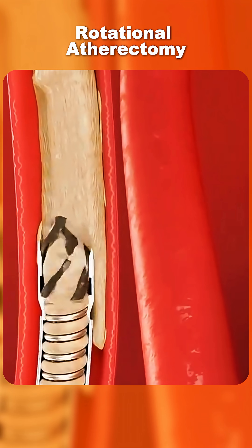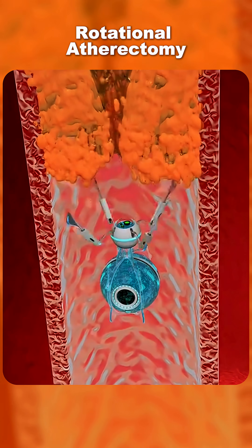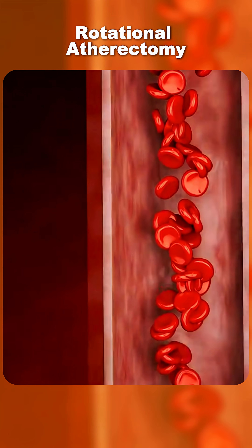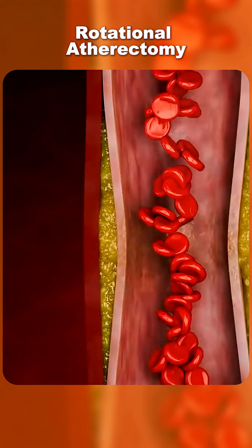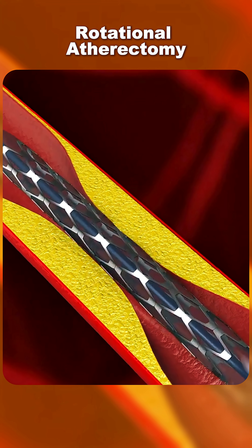Ever wondered how doctors remove hardened plaque from heart arteries? That's where a rotational atherectomy comes in — a specialized procedure used to clear calcium buildup inside coronary arteries when standard angioplasty can't.